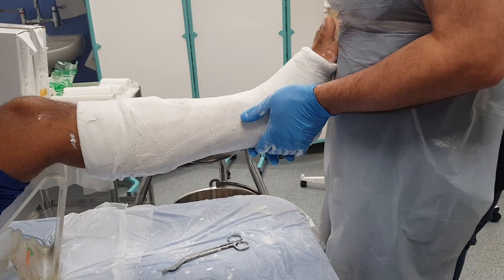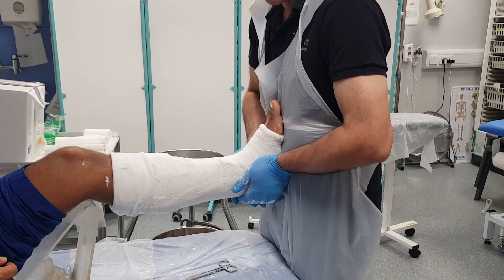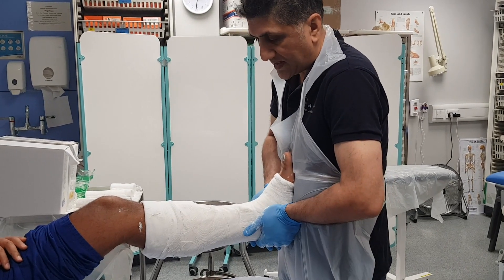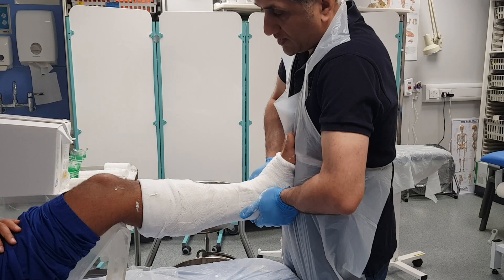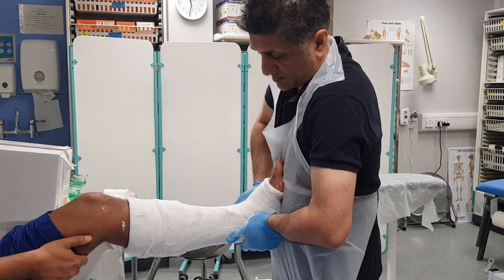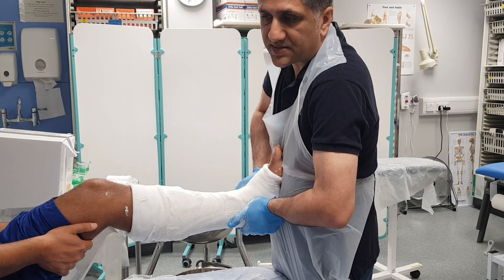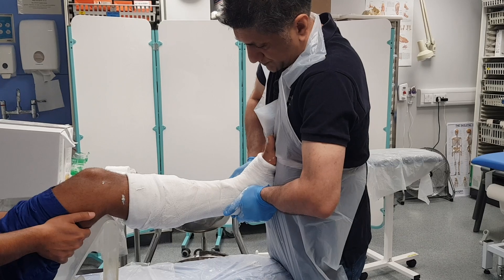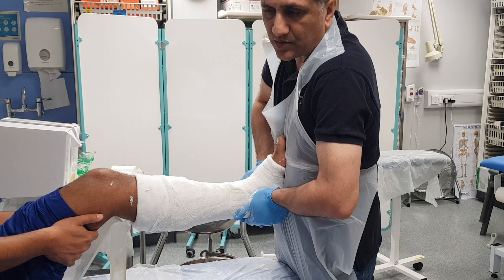Now I want the foot to be at 90 degrees — I've got the knee bent, and I'm going to use my abdomen to put the foot at 90 degrees to the leg. If it's an ankle fracture, I also want a little bit of internal rotation of the ankle joint. I'm going to internally rotate the ankle slightly, which will keep it reduced because the vast majority of these injuries are external rotation injuries. I'm using the palms of my hands to grip the hindfoot and ankle so that I don't cause any indentations — if you use your fingers you can cause indentations which could lead to a pressure sore.